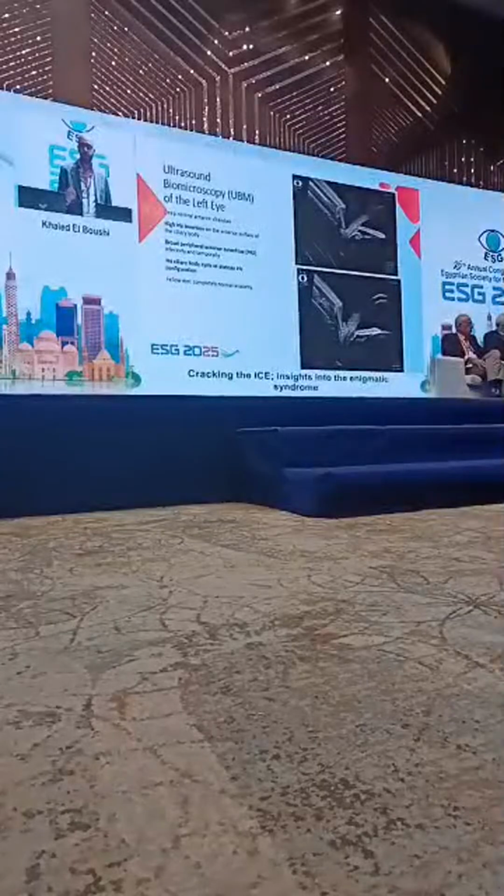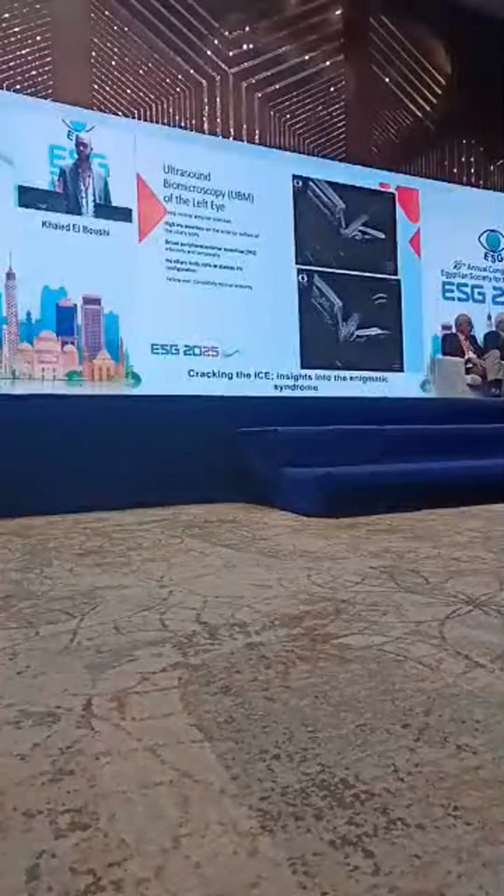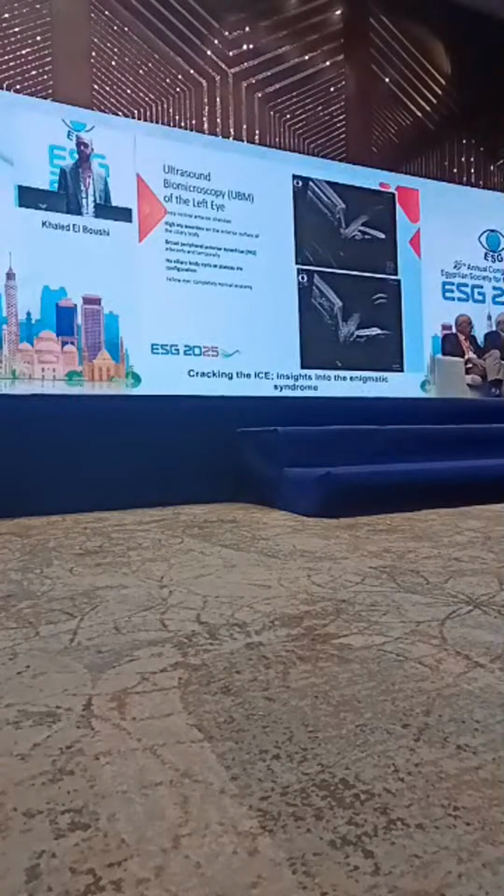So digging deep into the angle, we used ultrasound biomicroscopy for examination of the iris insertion. As we see in the left eye, in the inferior angle and the temporal angle, we have a very high iris insertion and broad peripheral anterior synechiae. On the other hand, in the normal right eye, we had normal iris insertion to the ciliary body and an open angle.